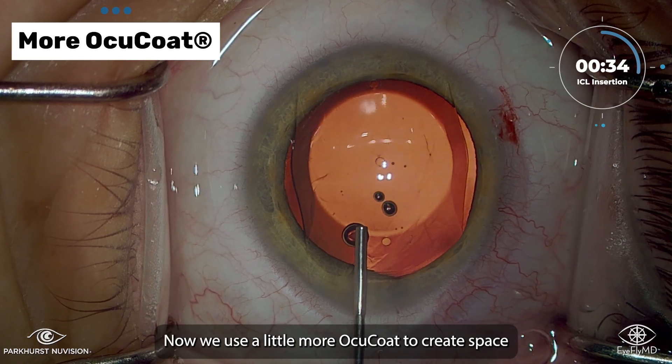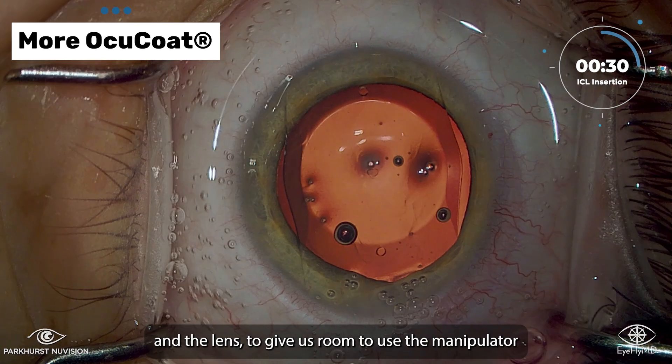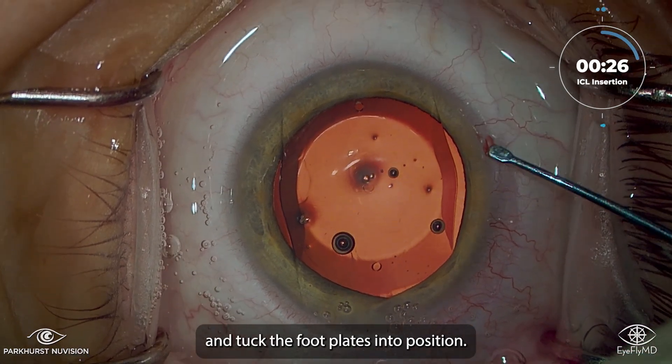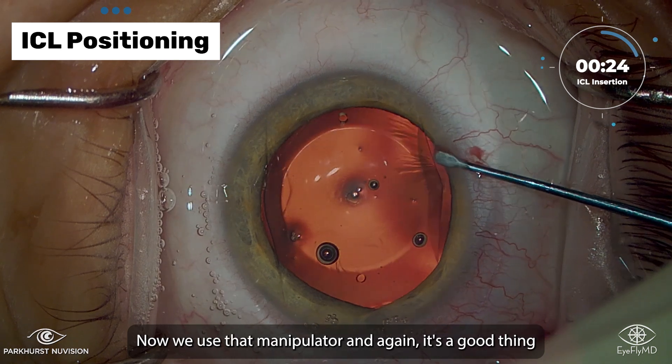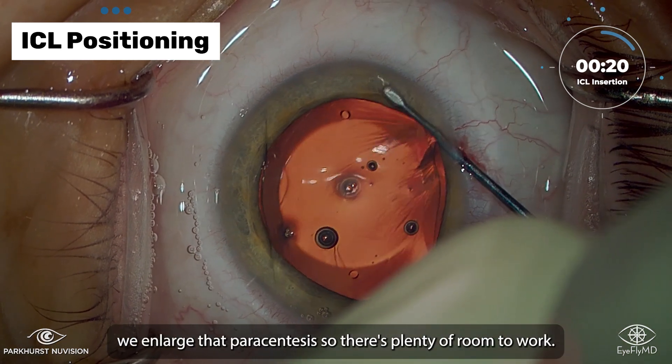Now we use a little more OcuCoat to create space between the endothelium and the lens to give us room to use the manipulator and tuck the footplates into position. So now we use that manipulator, and again, it's a good thing we enlarged that paracentesis, so there's plenty of room to work.